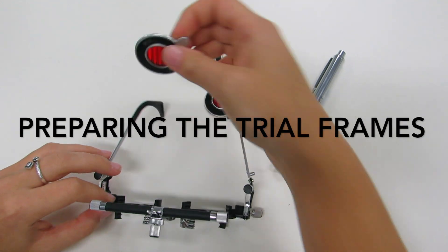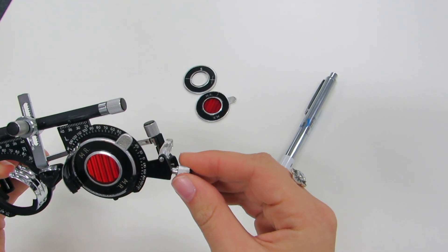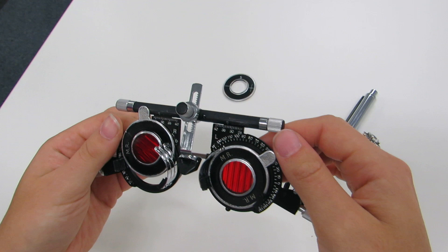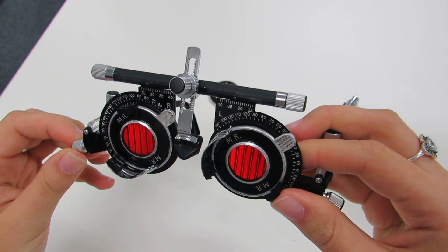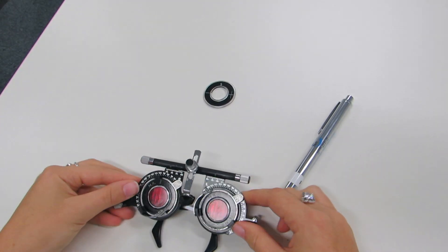To set up the trial frames ready for the test, place each Maddox rod in the trial frames and align the axis of the rods at 90 degrees. The image seen by the patient will be perpendicular to the rod, so in this case it will produce a horizontal line.